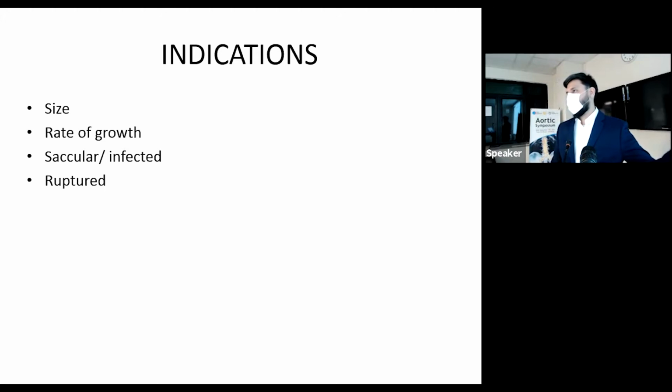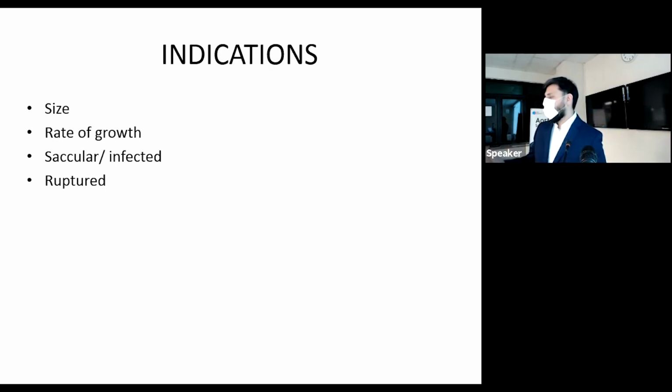If a patient has an aneurysm that can be treated endovascularly, the results are quite good. You really have to know your stents and know your sizes and know how to work around issues, because essentially you're working in an emergency situation with whatever you have on the shelf. And there are situations where you don't have that luxury of planning.